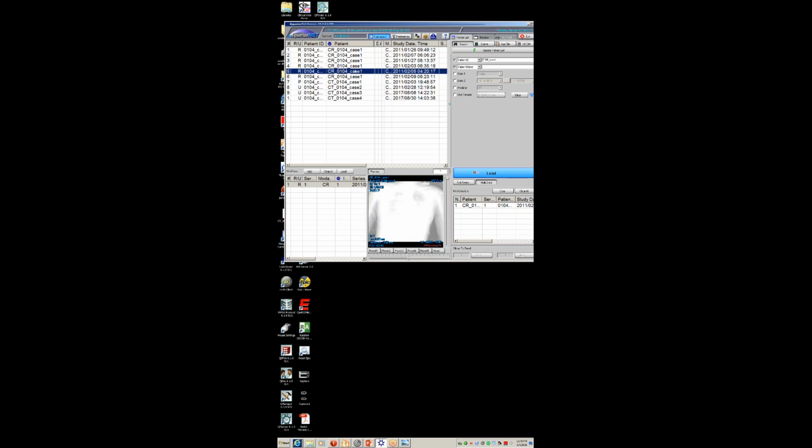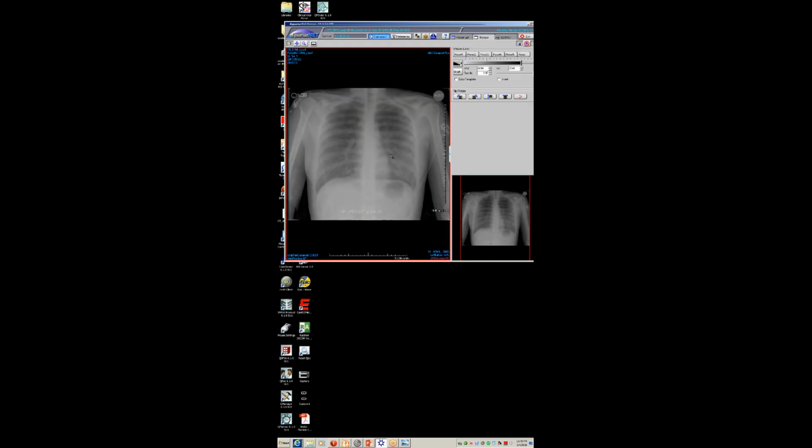Background of asthma by any chance? I have to look at her history. I agree, her initial chest x-ray does look like that. Looking at it when I read it, I thought she had some background of asthma. But to tell you the truth, Dave, I know chronic eosinophilic pneumonia has an association with hyperimmune states. I'm not sure about the association of hyperimmune states and acute eosinophilic pneumonia development. You would assume there would be some association, but I don't know. Good point. I don't know. Yeah.